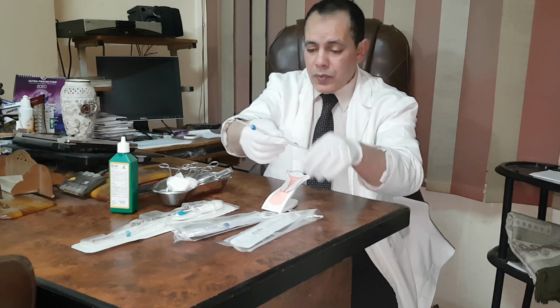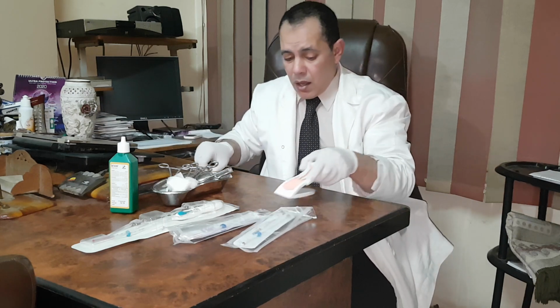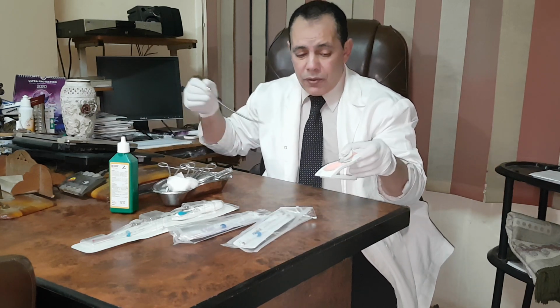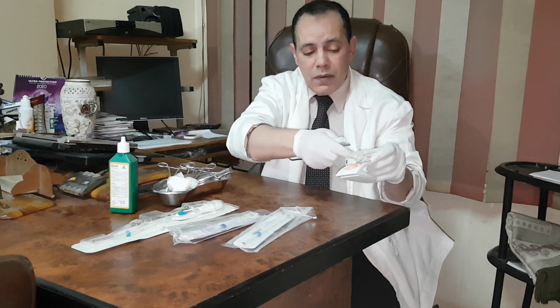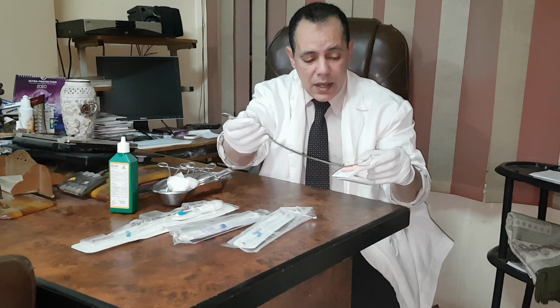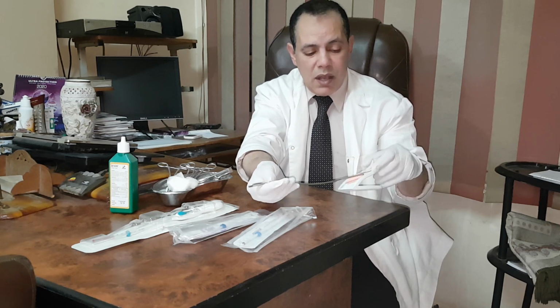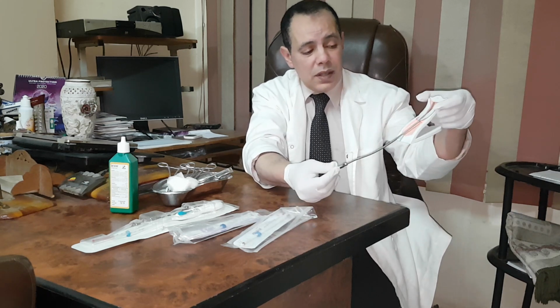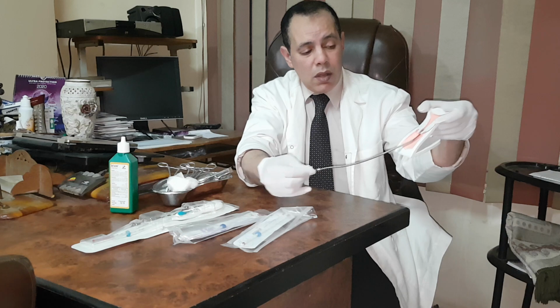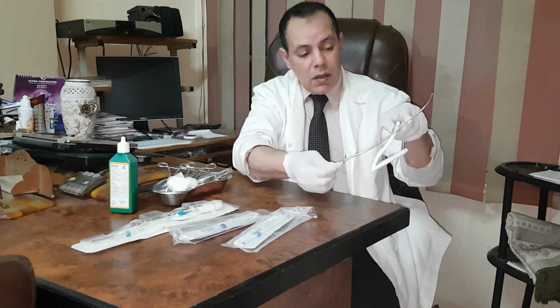So, first, after cleaning of the cervix from discharge and holding the anterior lip with the volsellum, I insert the sound like that. Why do I insert the sound? To measure the length of the uterus and to know if it is an AVF uterus or RVF uterus. Then I measure the length. Okay?